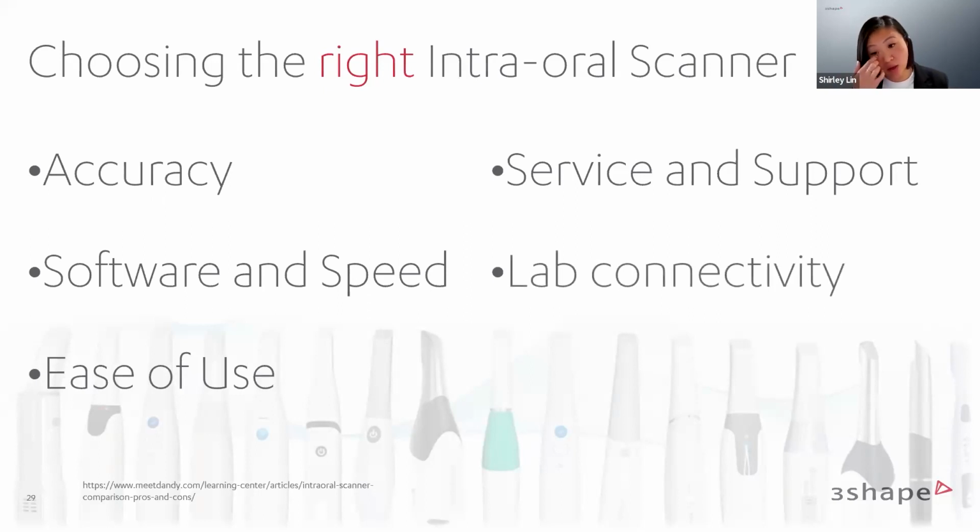Lab connectivity. I believe all scanners on the current market will allow you to export your digital files and then send them to all of the labs, because they normally accept all scans. But a direct connection to your favorite labs will, of course, provide more efficient and simpler workflows. So will your specific preferred lab also accept scans from the scanner you choose? Now, I know RACE accepts all files from any scan, but some other aligner companies may not.